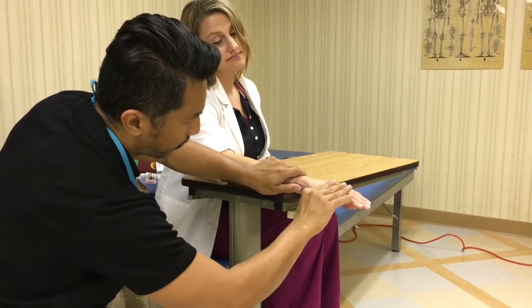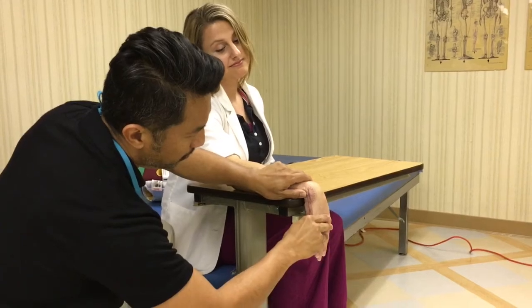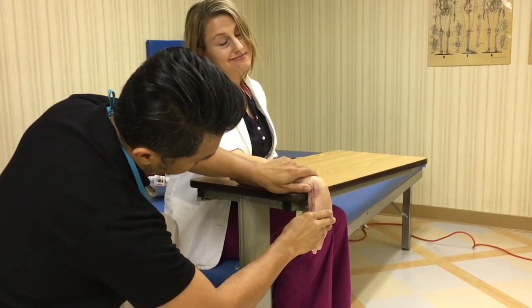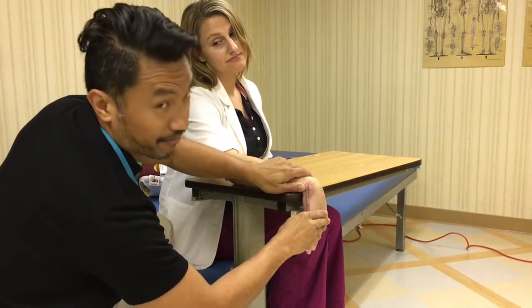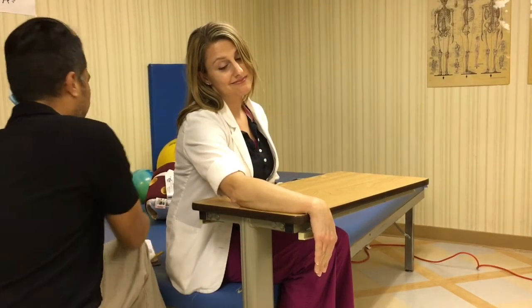Okay, go ahead, let's do the wrist flexion. So she is at 75. Let's list that down. 75 degrees.